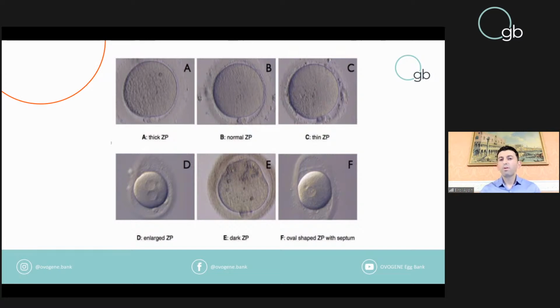Even if you have low zona birefringence, it will go smoothly inside the cytoplasm, and when you come out with the pipette, it will not be sticky, because the angle of the pipette is different from a regular ICSI pipette. You don't need to change the microscope setup. You can use the same regular ICSI setup, but if you use a non-spike ICSI pipette, you will always get a better outcome.